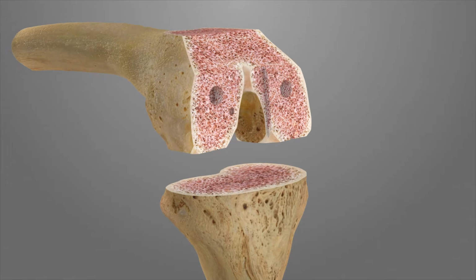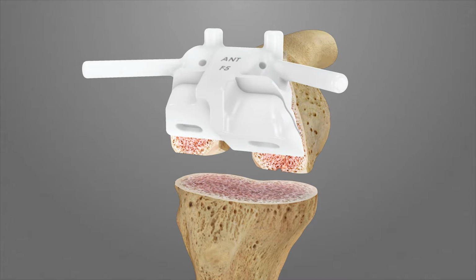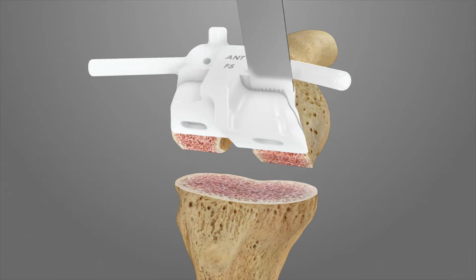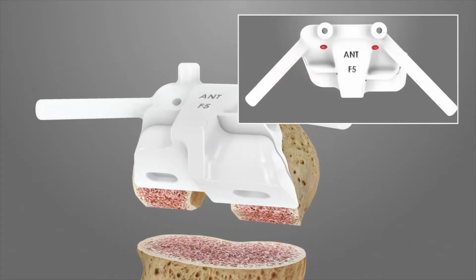Place the chamfer iJig F5 onto the distal femur so the pegs fit into the previously drilled lug holes. Impact F5 by hand, or if needed, by lightly tapping with a mallet on the impaction surface. Do not impact the cutting surface. Complete the open bottom chamfer resection first, followed by the captured top chamfer resection. The F5 iJig can be stabilized using the handles on the medial and lateral edges, or the iJig can be pinned into place on the anterior surface using Steinman pins.